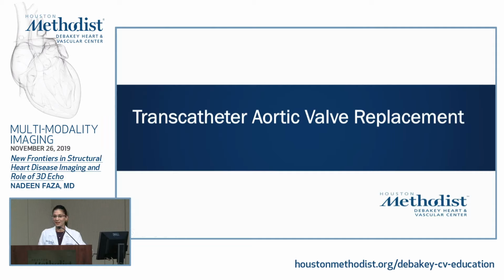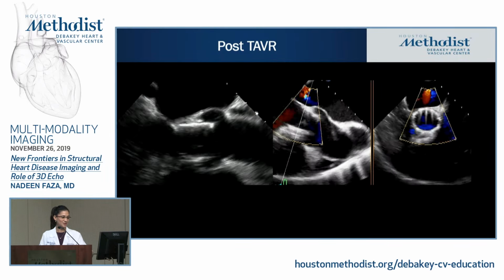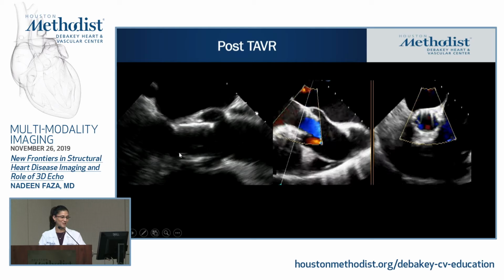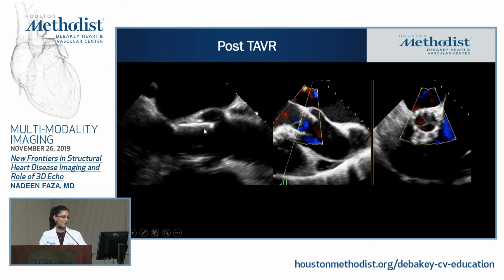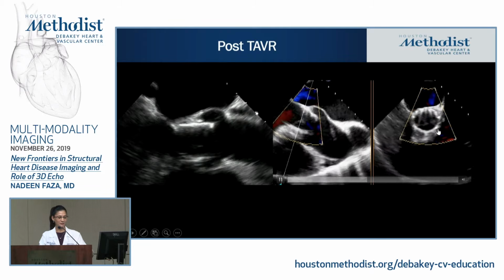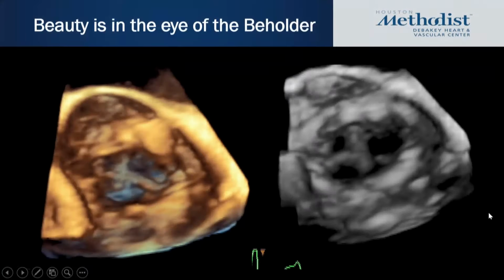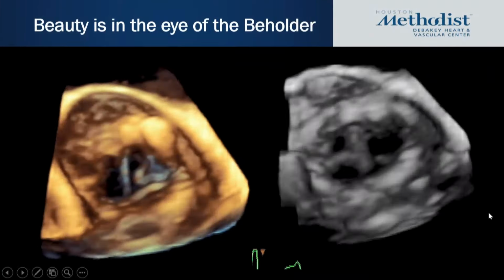Moving on to TAVR. Nowadays, we're using more TTEs in TAVRs. So I'm not going to spend too much time discussing the role of 3D echo, but when we do use 3D, I think it's visually nice for a post-TAVR assessment. Here we have a TAVR valve deployed. You assess for regurgitation, PVL, and if you see it on 3D, I think it looks much nicer. So this is the role of 3D echo for me.